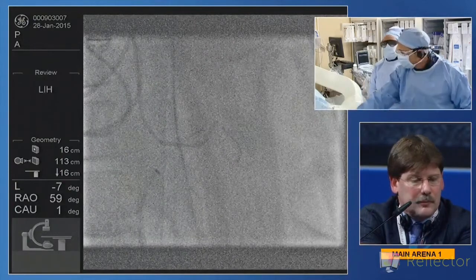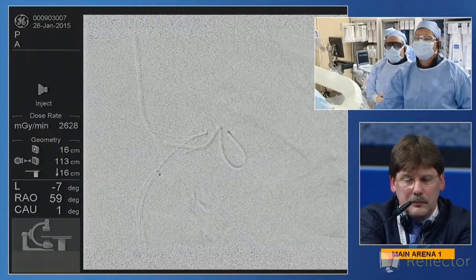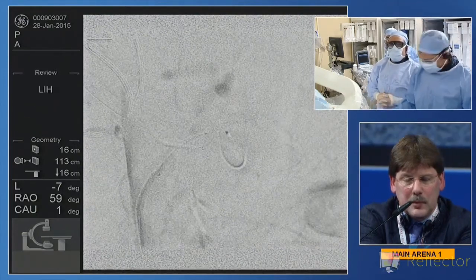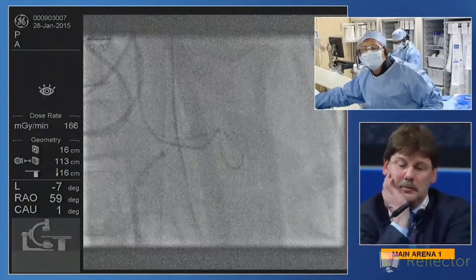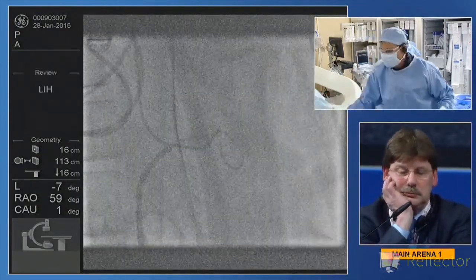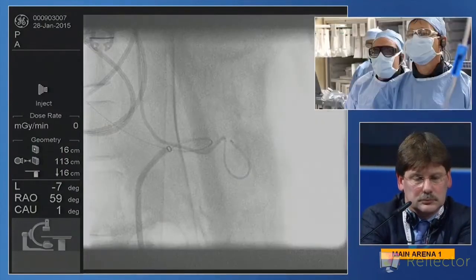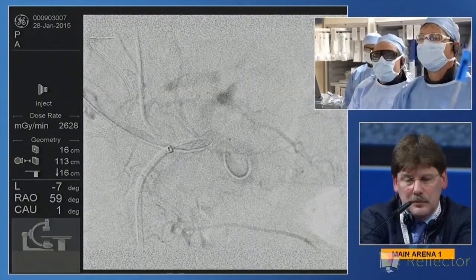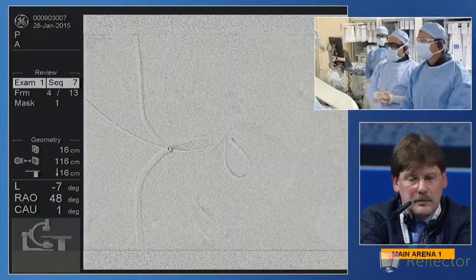Hold your breath, please. Don't move and don't breathe. All right, it's a little bit hard to see. Let's get this up a little bit more. Like that. There you go. One more time. Hold your breath. We'll get an AP. Yeah, that looks really great. And let's go up to an AP here.